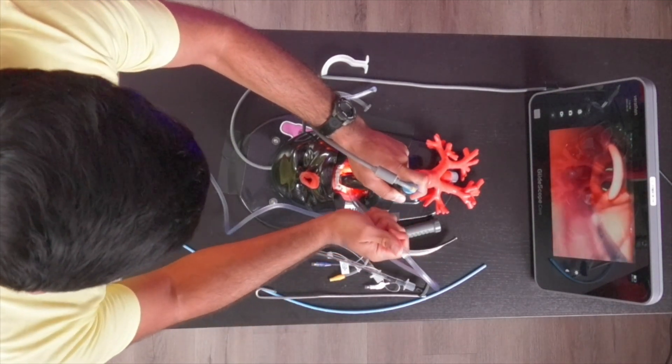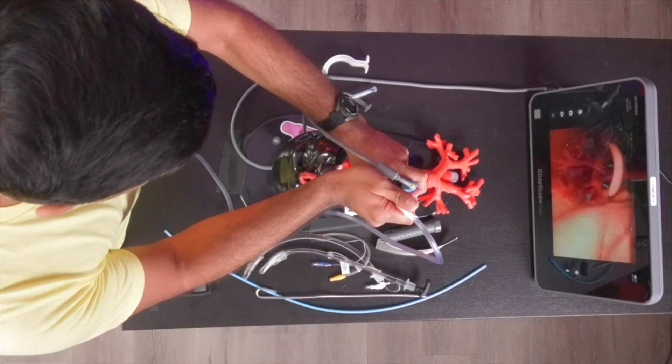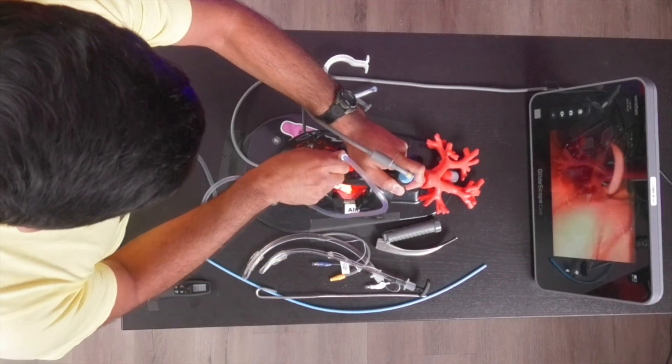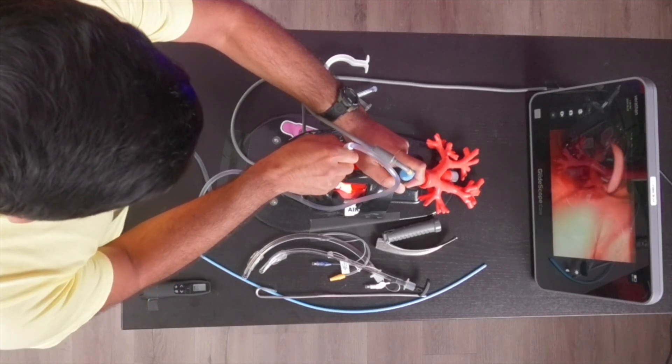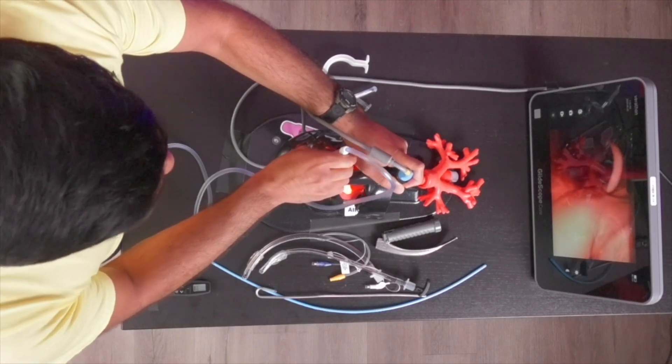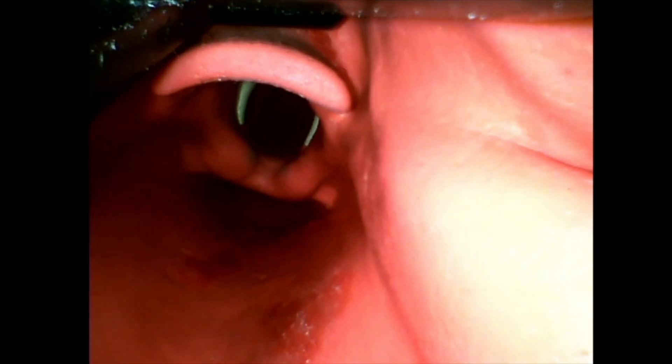We're going to use a technique called the suction park technique. That's where you pull out the suction and bring it to the left side of your laryngoscope. What that allows you to do is free up all the space on the left side and seat the suction catheter into the esophagus. Ian, can we see the glidescope view here? Initially I was suctioning on the right side, and now I'm taking the suction out and bringing it over to my left side, seating it into the esophagus, which gives me room on the right side to bring my endotracheal tube in.